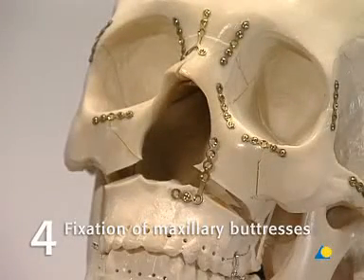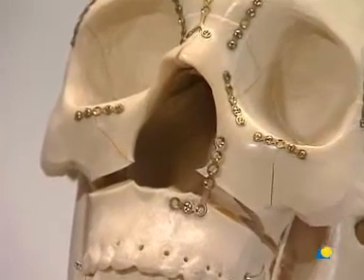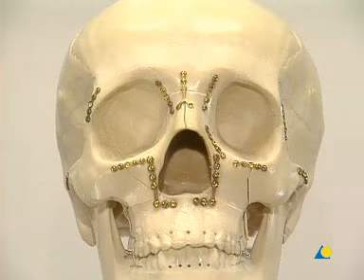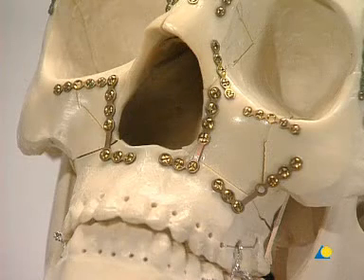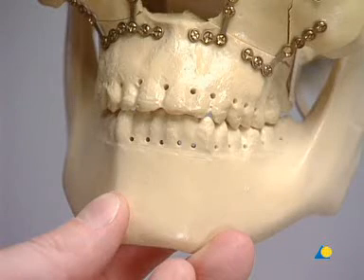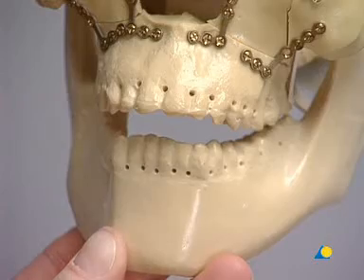Fixation of maxillary buttresses. If the MMF was not applied earlier, it must be applied now. The LeFort 1 fracture is stabilized with 1.5 L plates. The fracture is reduced and fixed with plates along the nasal buttresses; when placing the caudal screws, the tooth roots must be avoided. Fixation is finished with two more plates at the zygomatic maxillary buttresses, where the bone is considerably stronger than over the maxillary sinus. Following reduction at the LeFort 1 level, the MMF is removed and occlusion is checked, completing the plating of the basic framework of the midface.